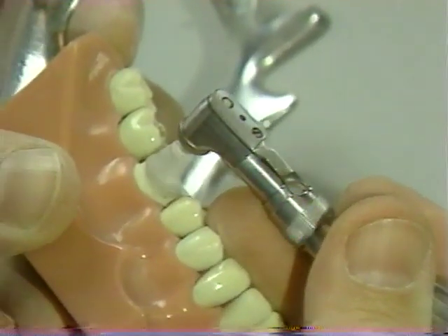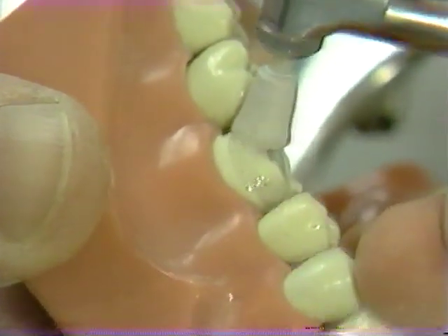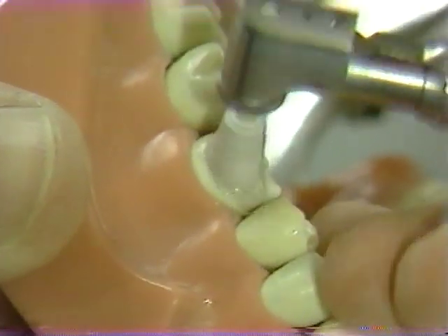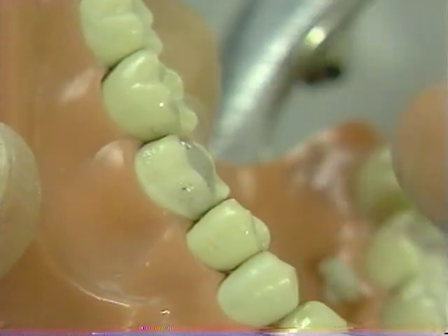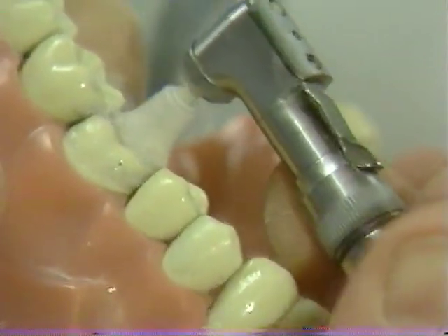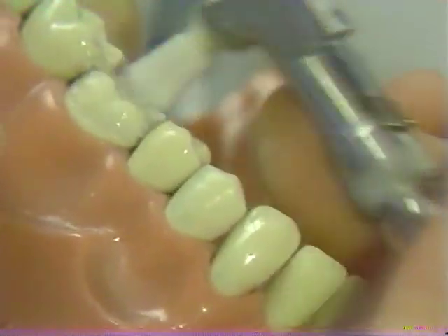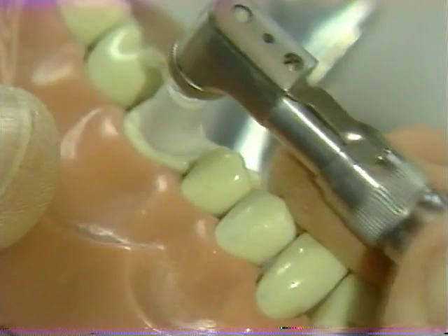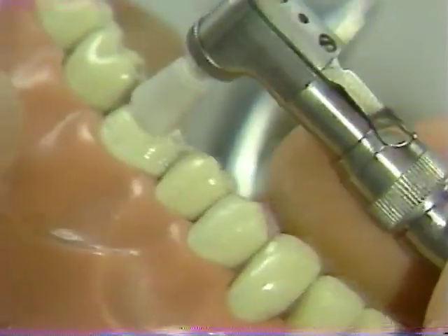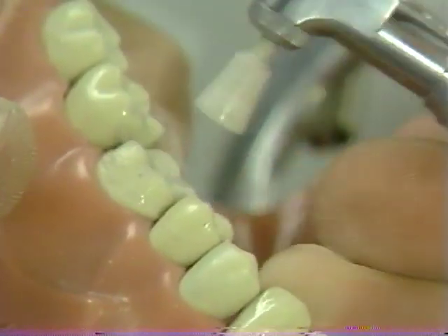A pumice wash is next applied with a rubber cup. The primary purpose of the pumice wash is to clean off debris rather than to buff up the surfaces of the tooth preparation. A wash with air and water is used to clean off the excess pumice.